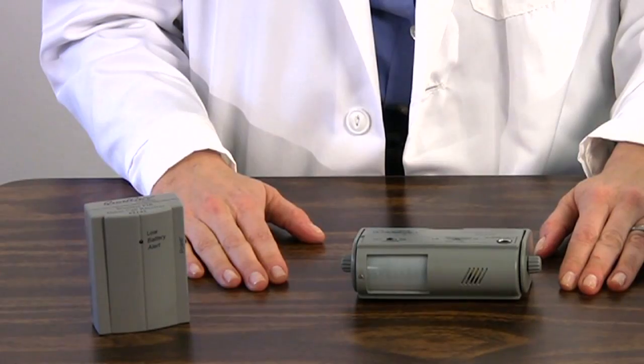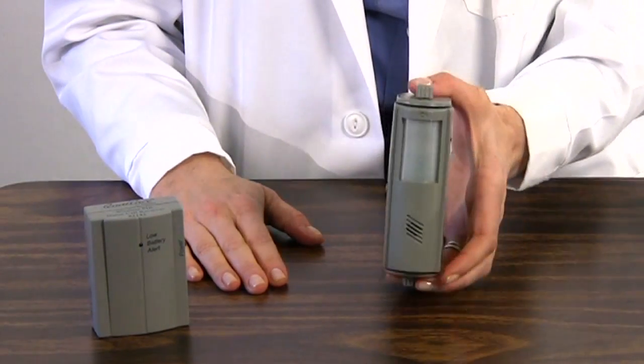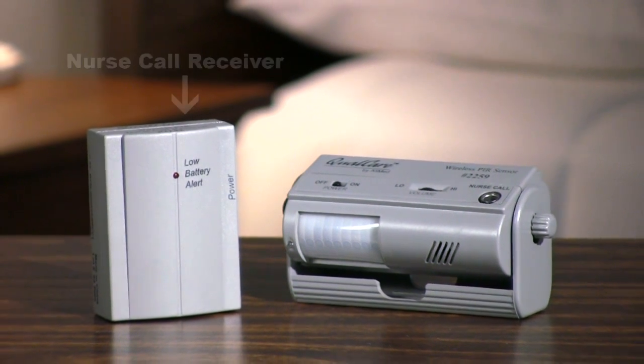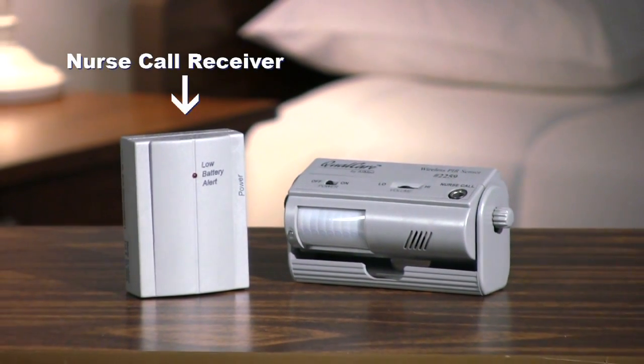Like System 1, System 2 bed alarm with nurse call receiver comes installed in a swivel mounting bracket and includes one 9-volt battery. It also includes the nurse call receiver which allows alarm transmission to the nurse's station.